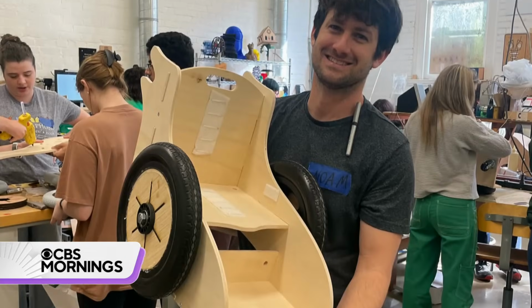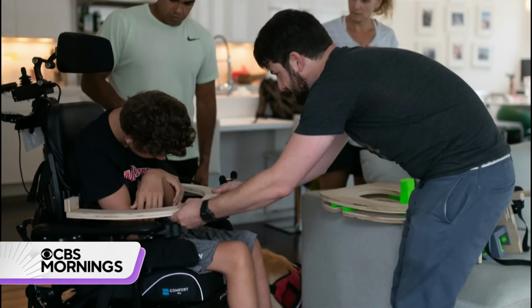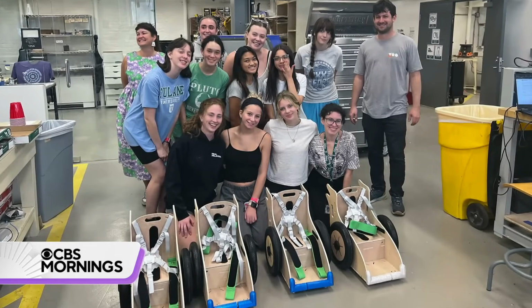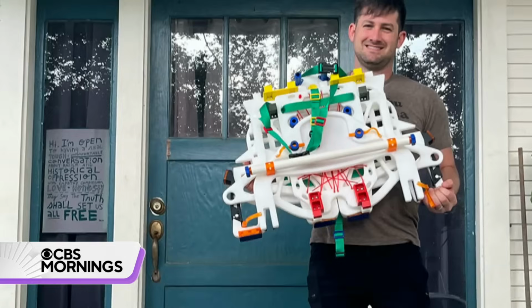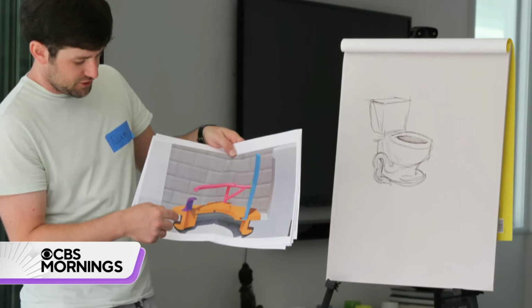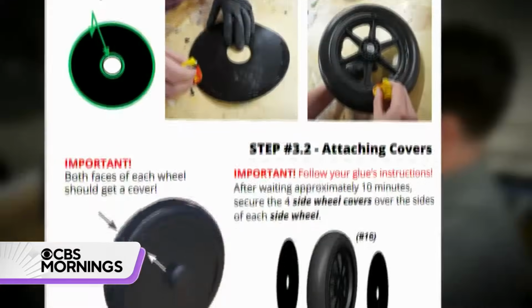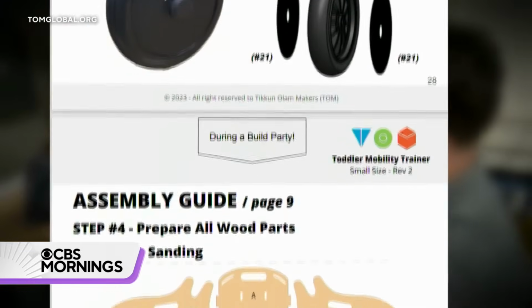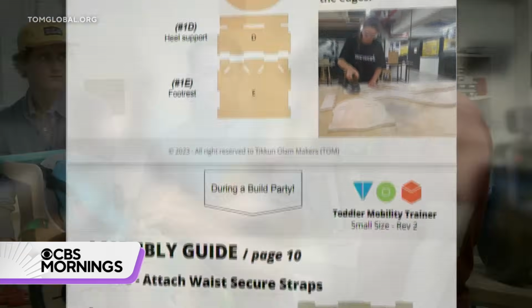Now, meet the man at the front of this creation, Noam Platt. He's an architect in New Orleans who heads up an organization called Make Good. They focus on assistive technology, the kinds of devices people can't find in the commercial marketplace or can't afford. Platt came across the design for the chair on an Israeli website that lists open source information for developers like him. We can go beyond what's commercially available. We can really create almost anything.